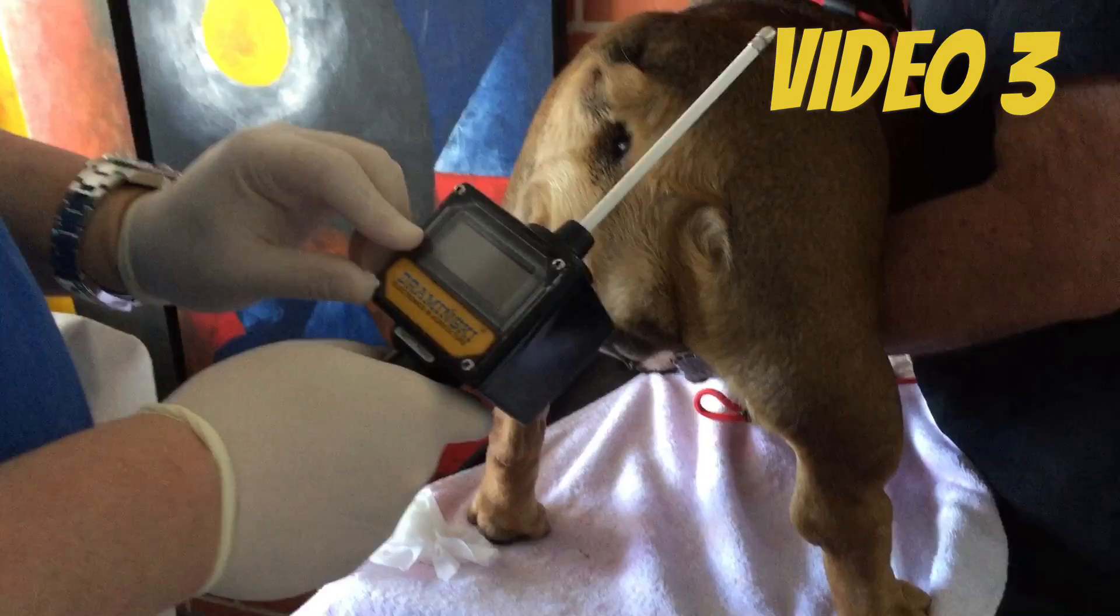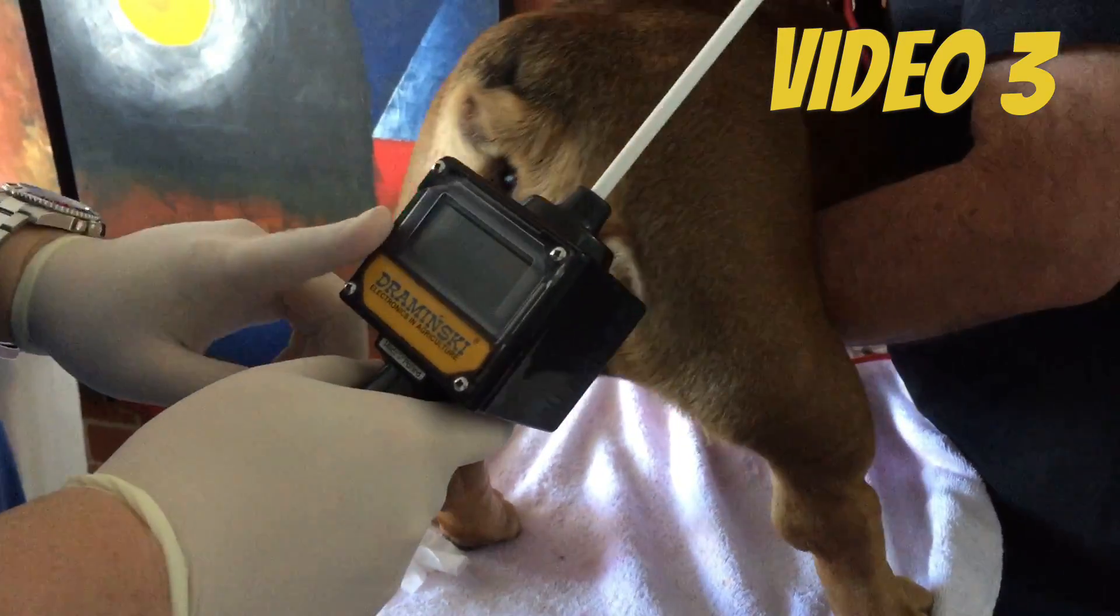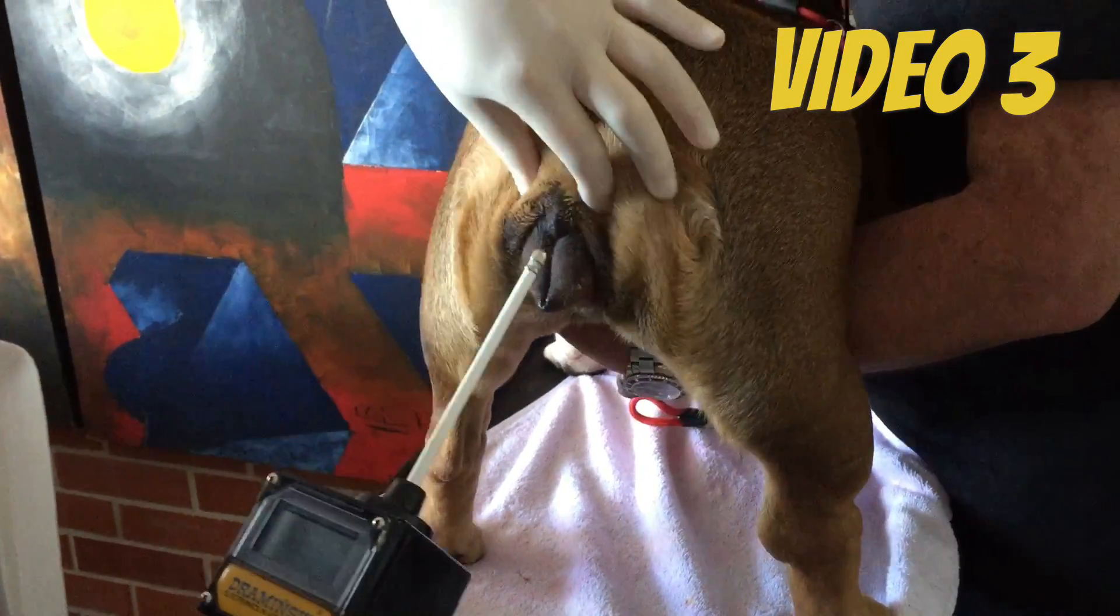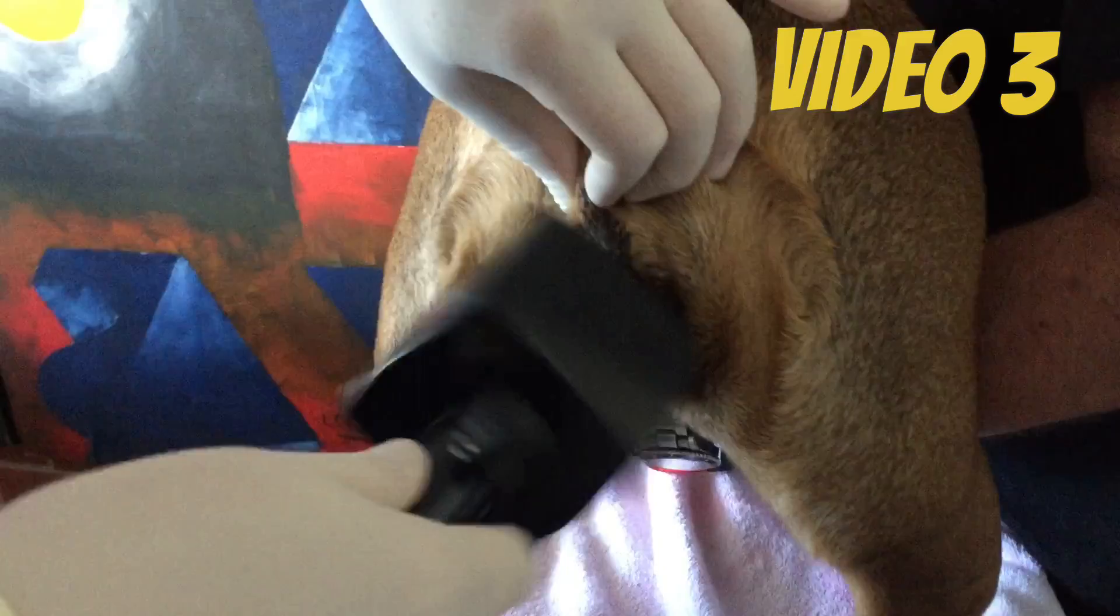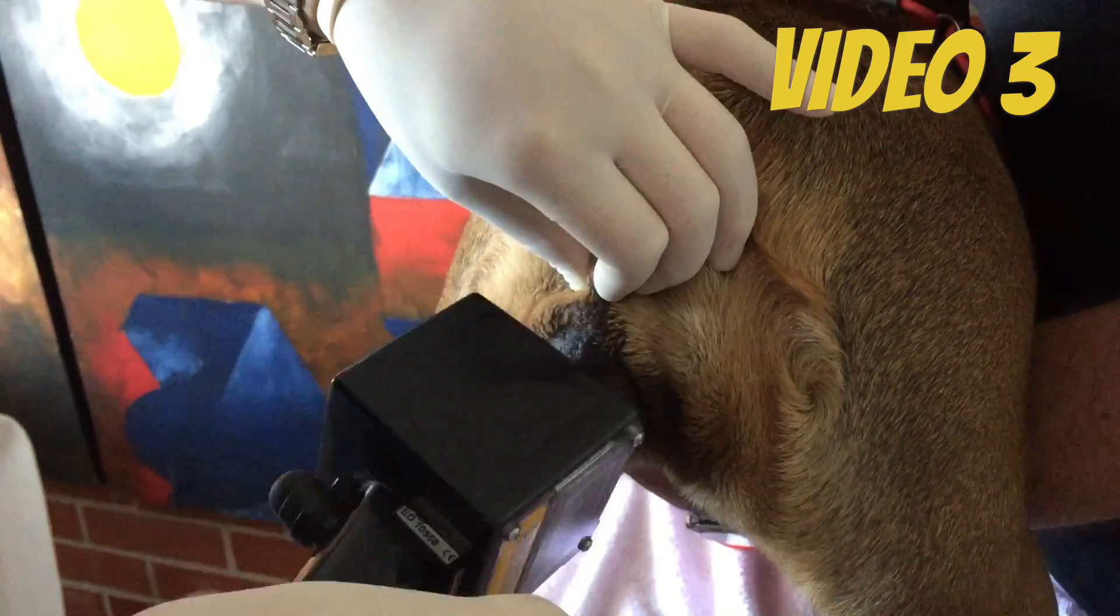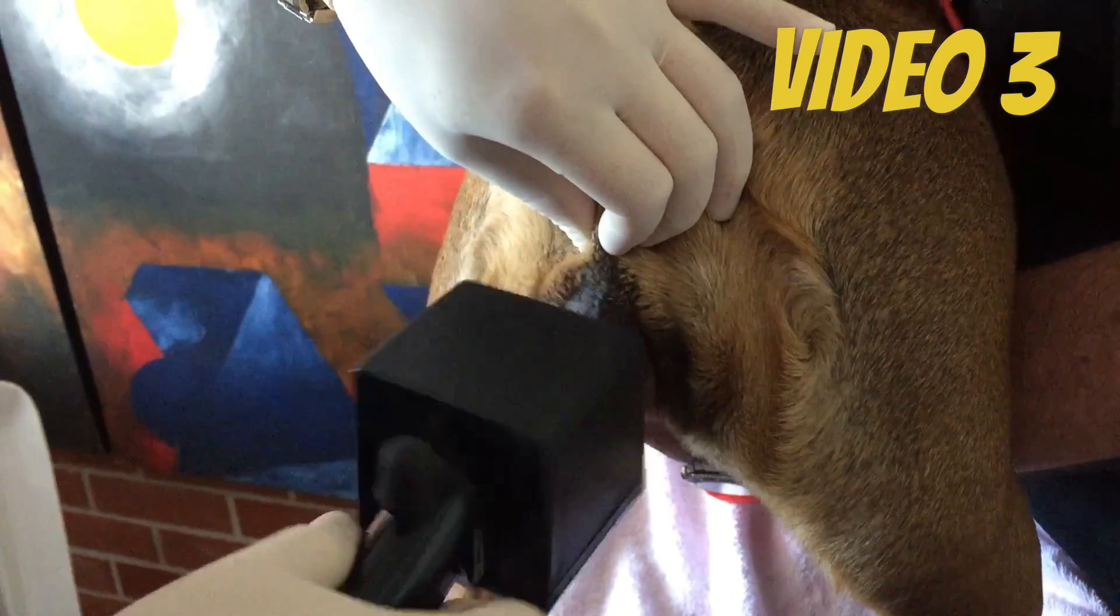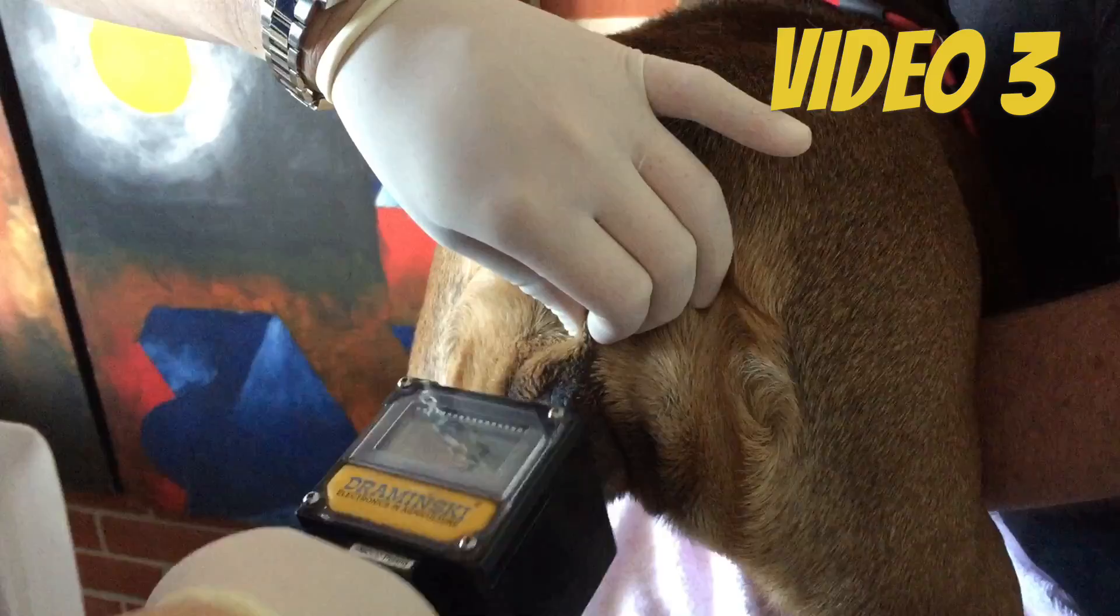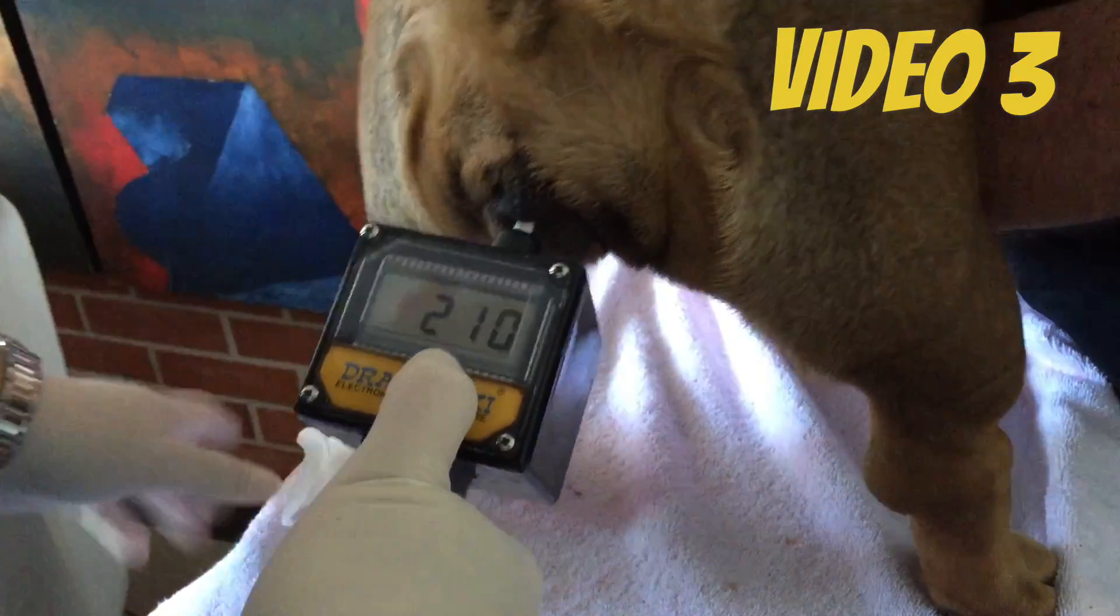Okay, the first day the Draminsky was 980 or 970, yesterday was 380, and today we're gonna see where she's at. You twist it. Okay, so it dropped to 210.